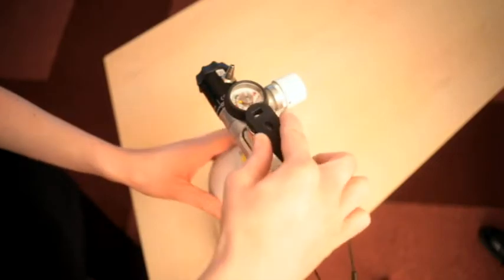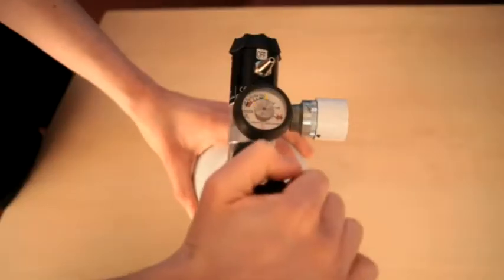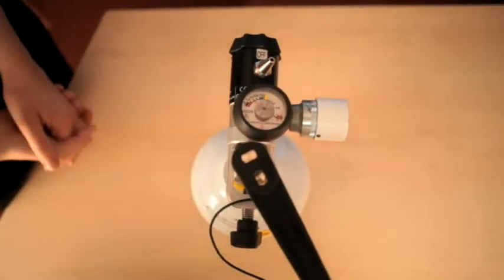Turn on the cylinder valve slowly. Check that the contents gauge points to a green or white part of the dial. If there is insufficient gas for treatment, replace the cylinder.